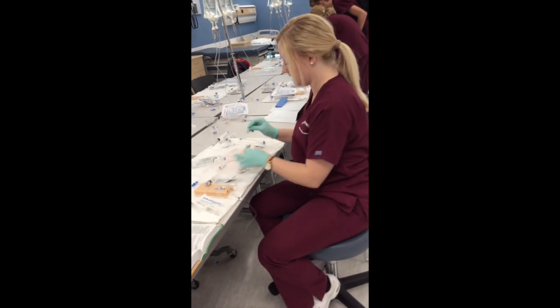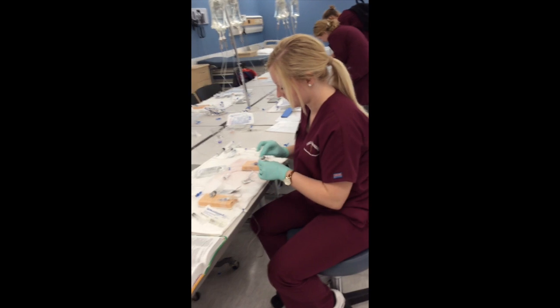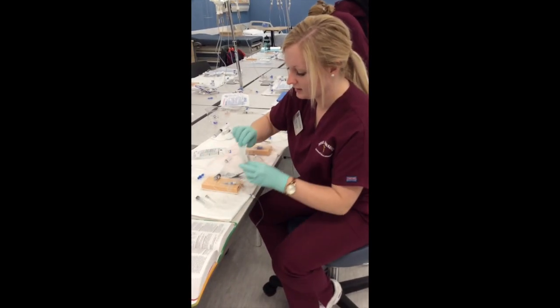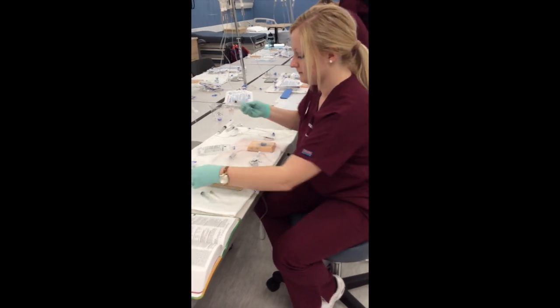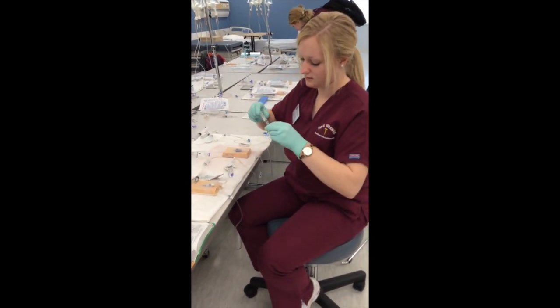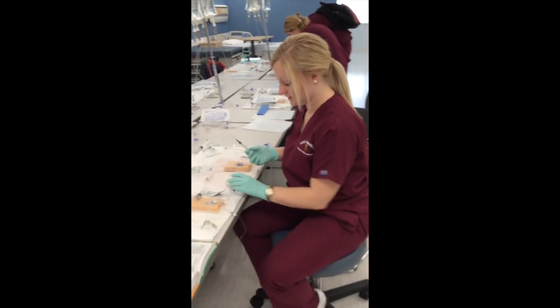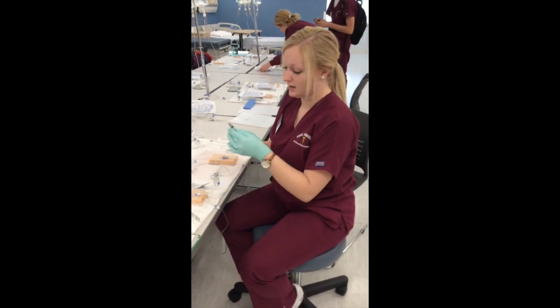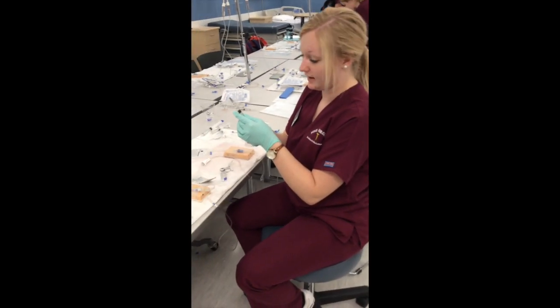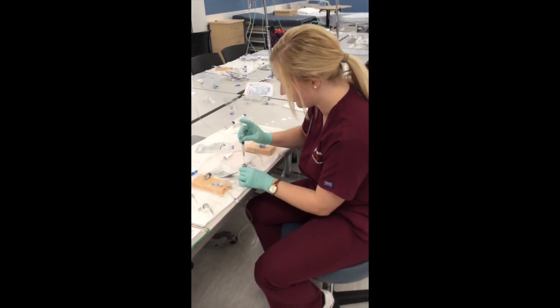I'm going to clean it for 30 seconds. And then I'm going to get my syringe and my needle ready. Okay. And like I said, I'm going to make sure once again, yes, I'm going to be getting out 2 milliliters of this morphine. And like I said, I'd have to have another nurse witness my wasting of it since I have to draw it all up.